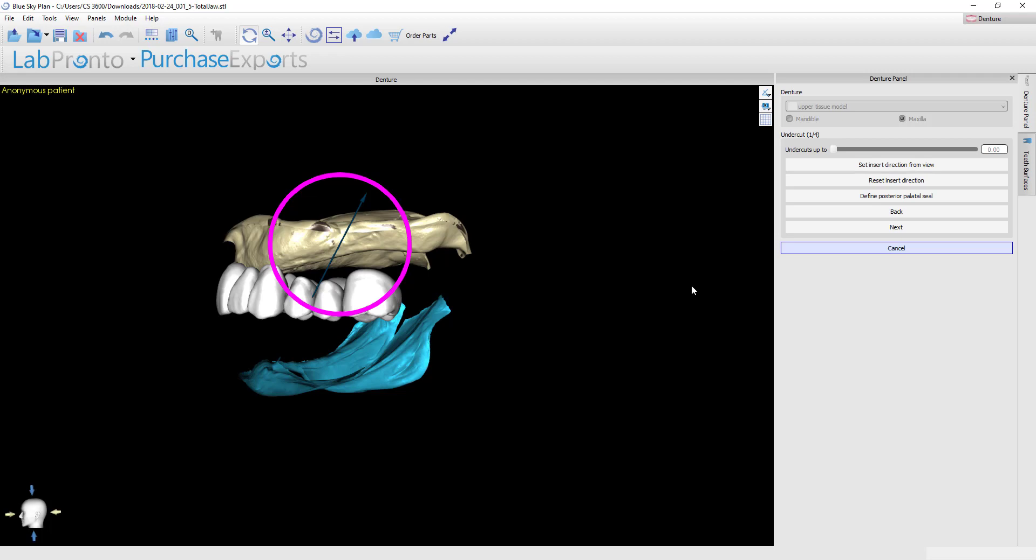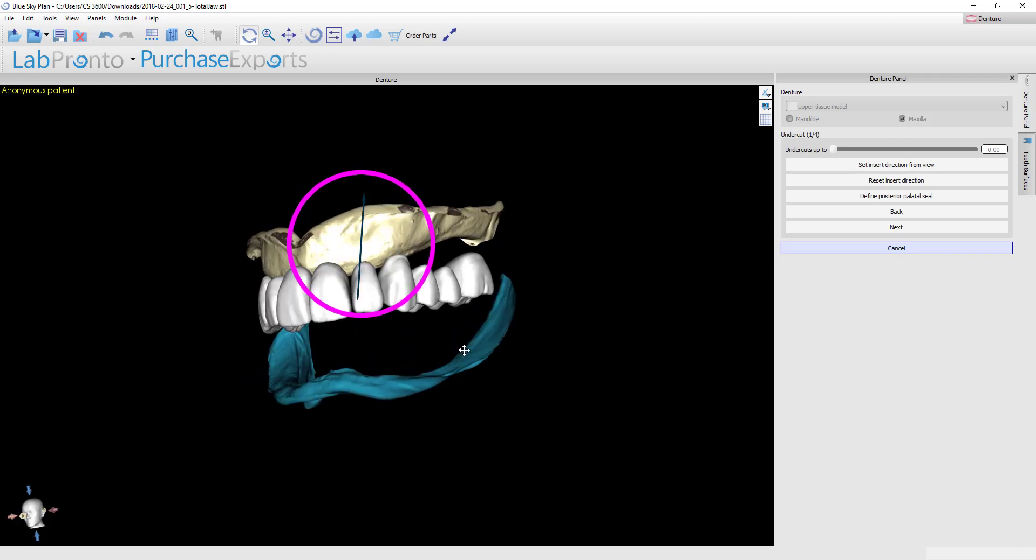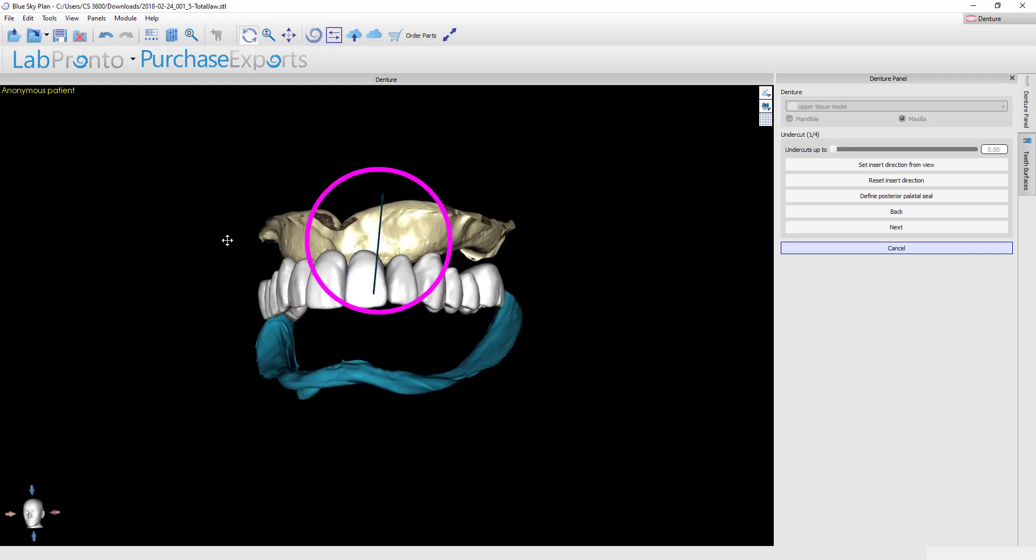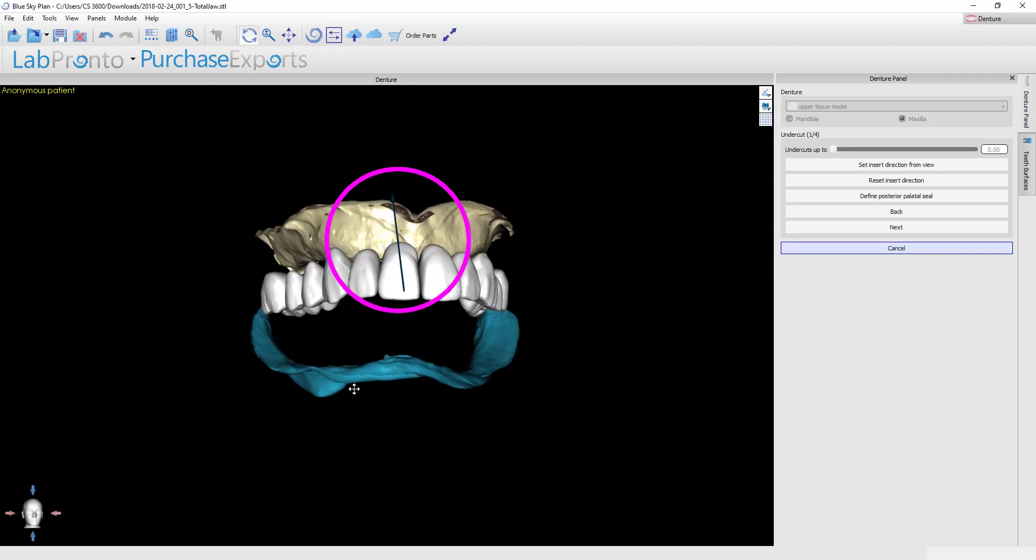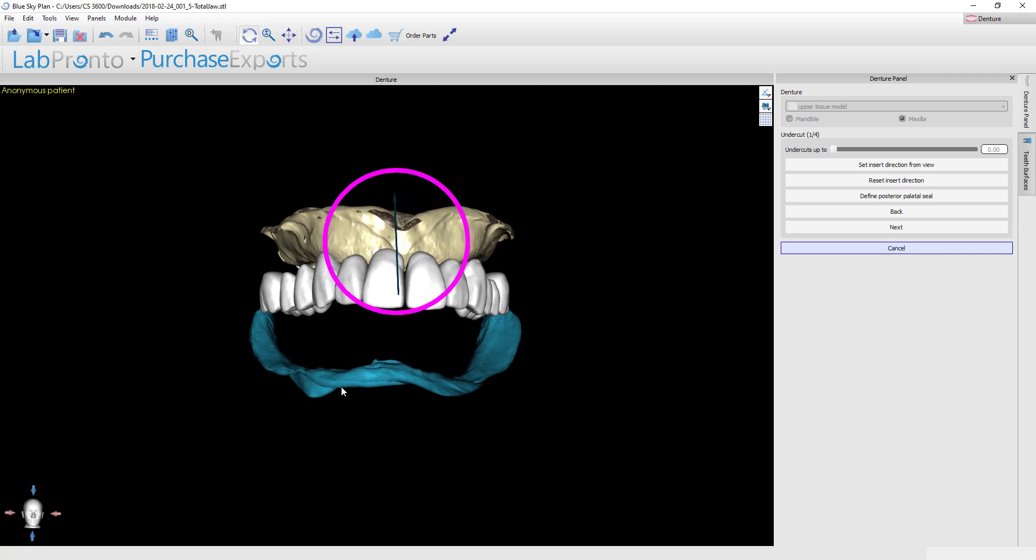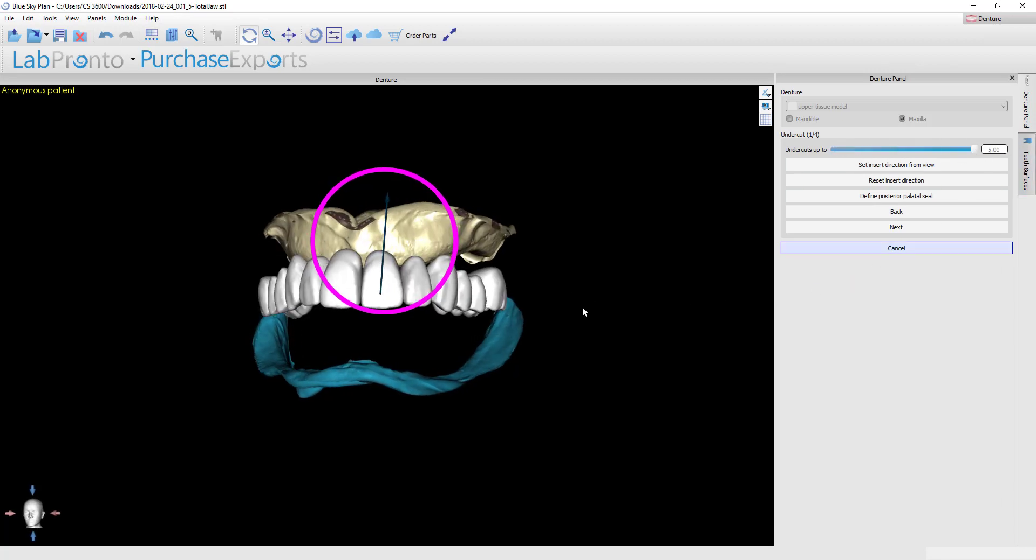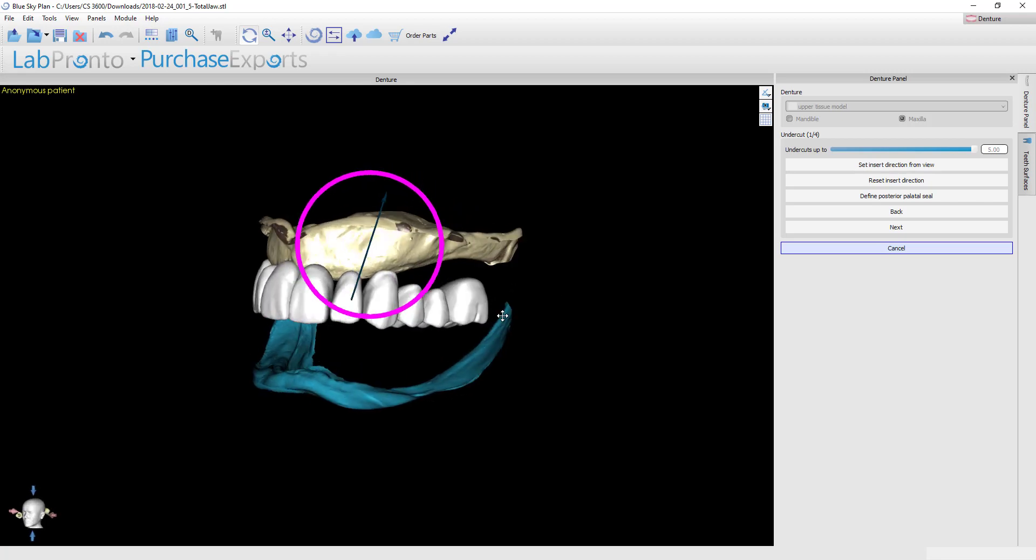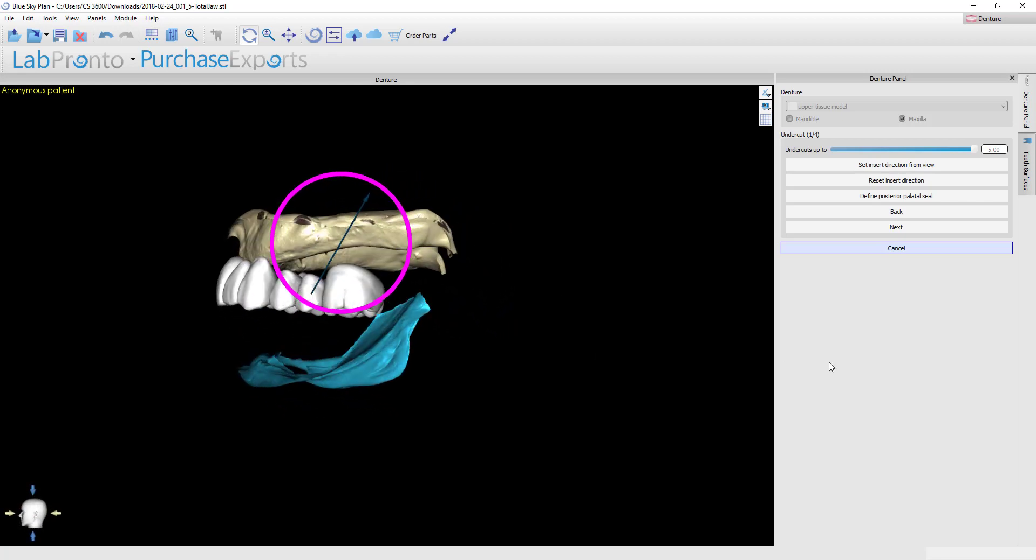If on the other hand you intend to just print this and directly deliver it to the patient, I personally prefer to maintain all of the undercuts unless they're extremely severe. Just a little bit of an undercut—it's tissue so the tissue will compress and get out of the way and it will actually contribute to the overall fit. I would only remove any undercuts clinically in the mouth if I find that the patient is having pain putting the denture on and off. For my case, I'm going to take this all the way up to the very maximum, which is 5, and we're going to allow this to engage all of the undercuts.